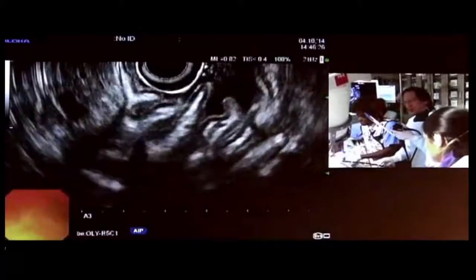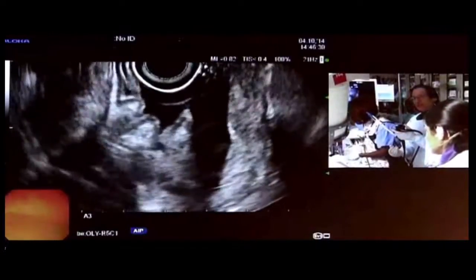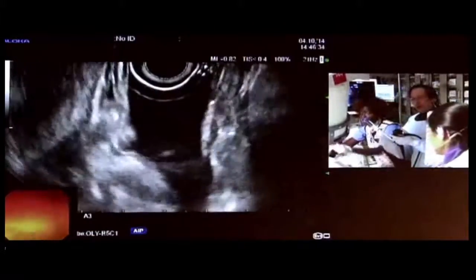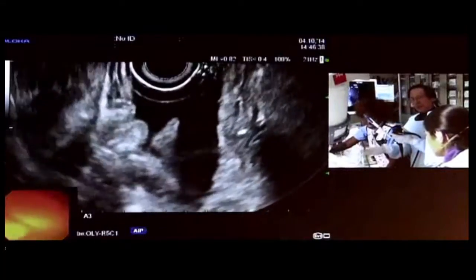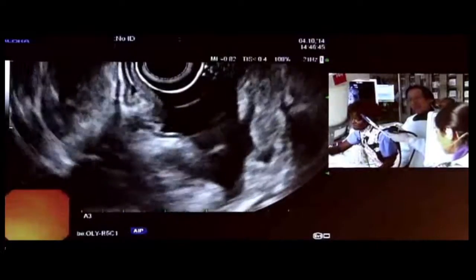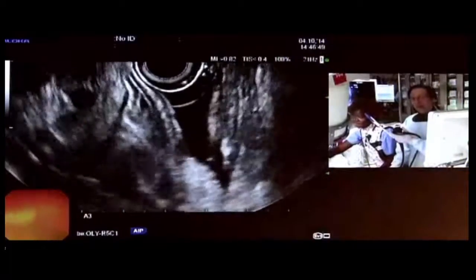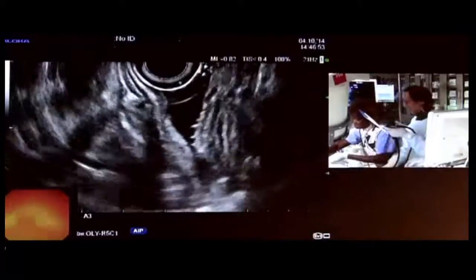The other possibility would have been the prone position, but I've found many times that with the prone position, you're kind of locked into that one position. It's just hard to maneuver the patient, to change the patient's position. So with the patient supine, you can move it up a little bit, move it back more, make the patient flatter. So it's particularly important when you're doing work at the hilum of the liver to really define the anatomy well. You need the patient in the supine position.